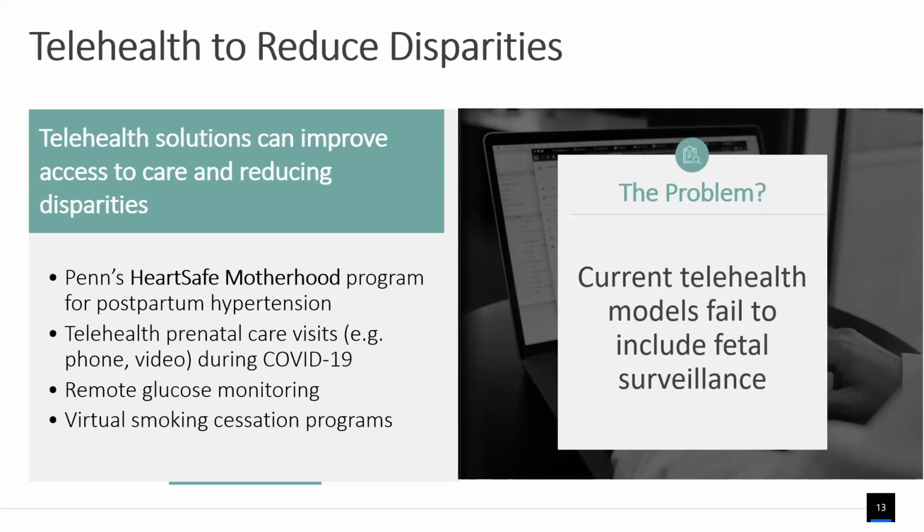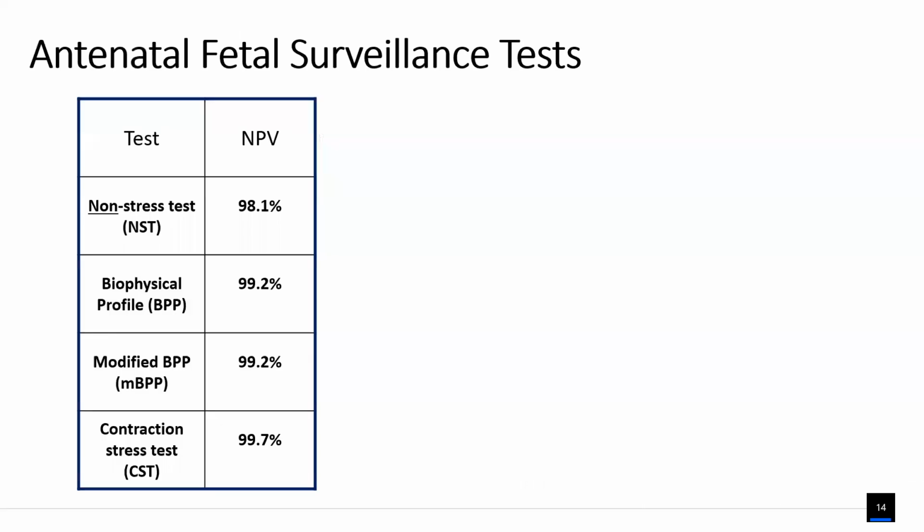But one thing that the current solutions don't address is fetal surveillance. Even a lot of the papers that came out during the pandemic, on how SMFM or specific institutions dealt with the crisis of reducing the number of in-person visits, none of them had a great solution for fetal testing, for fetal surveillance, with patients at risk for stillbirth. And that's because the technology wasn't there yet. So that's what we're going to try to think through.